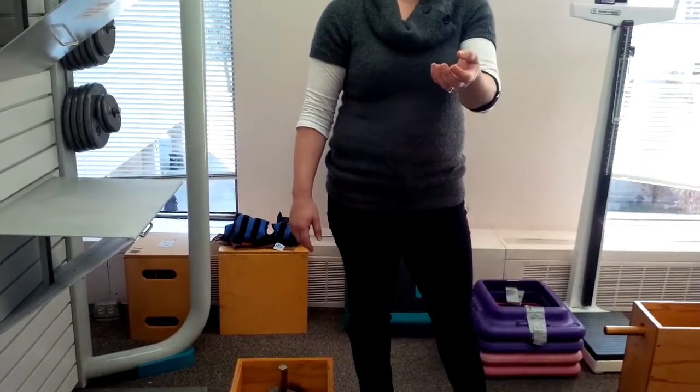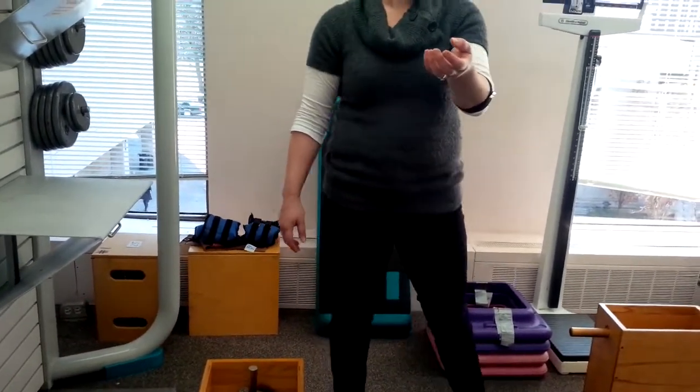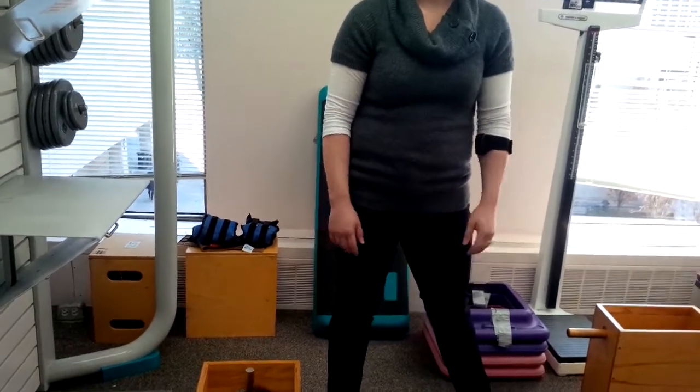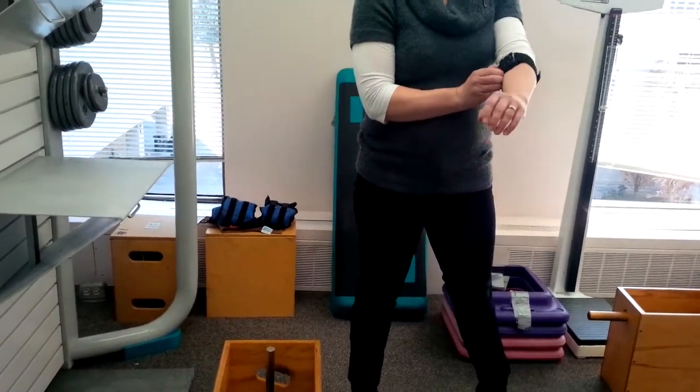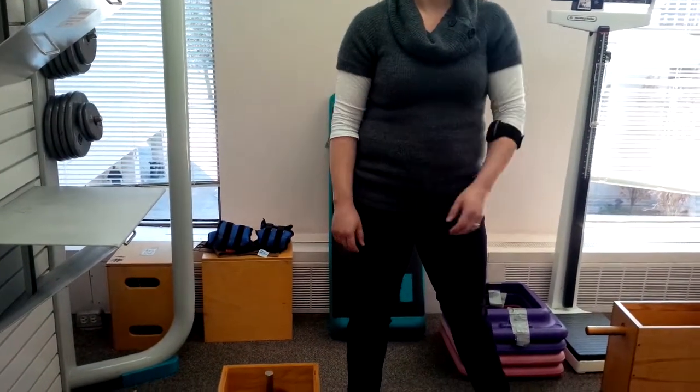And what are you at now? 115. 115. So then that's typical — it takes a little bit for the heart rate to respond to the exercise that's been induced. So then we add more weight.